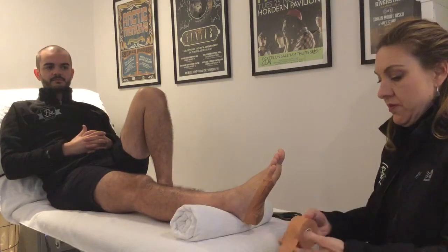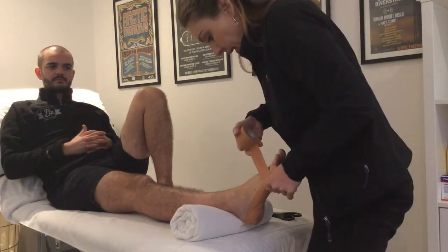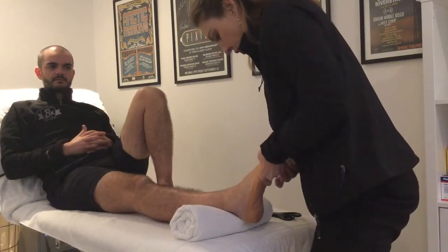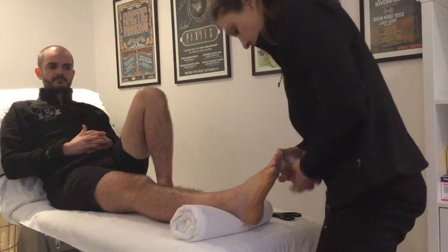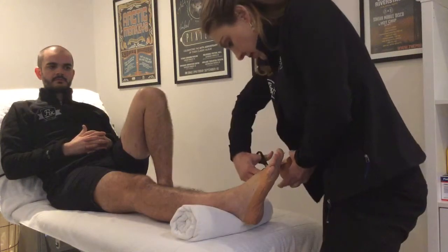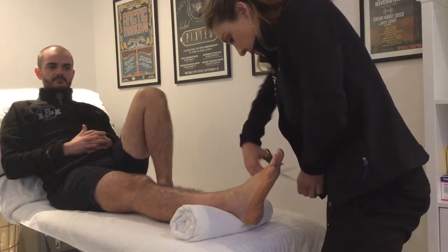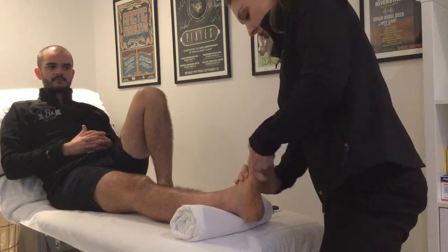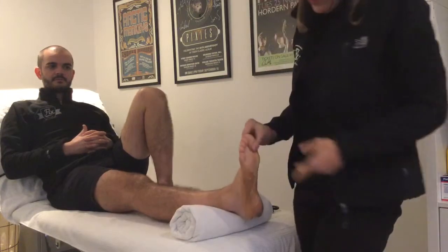The anchor goes across the top of the foot just to hold it all together, making sure not to do this last anchor too tight. And there's your low-dye plantar fascia tape.